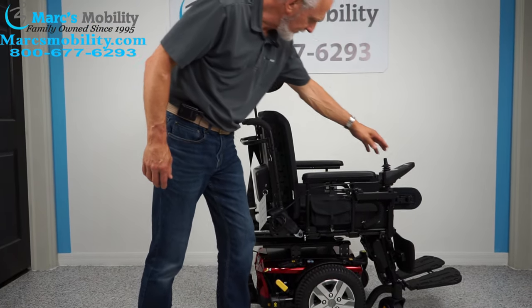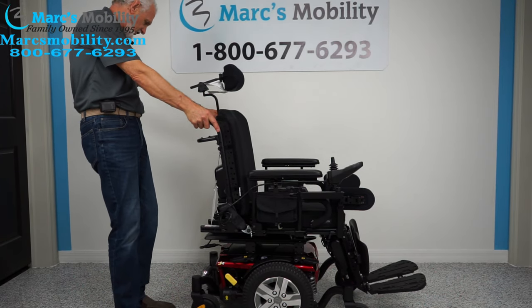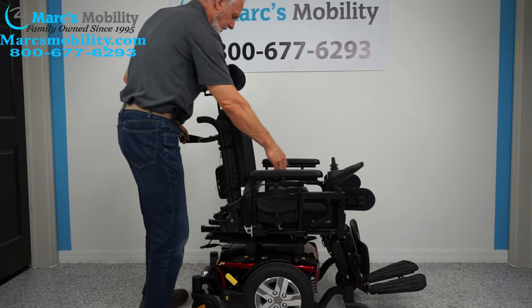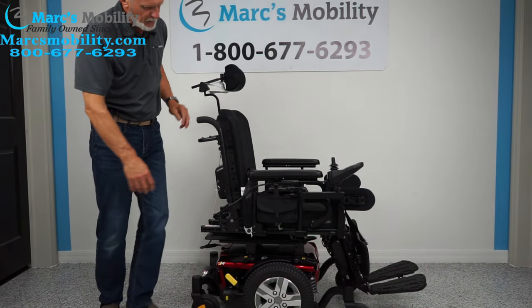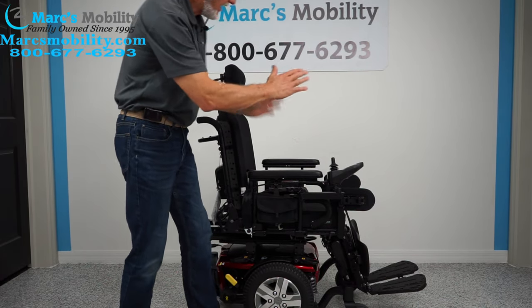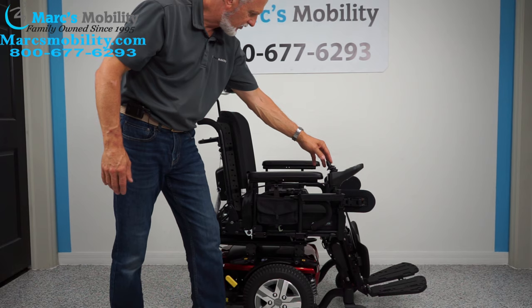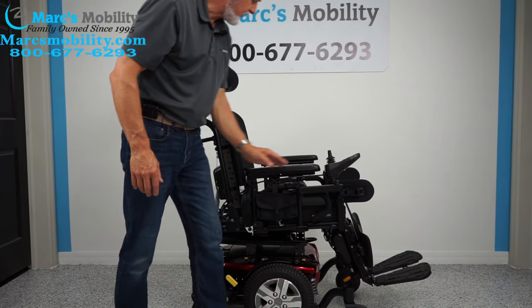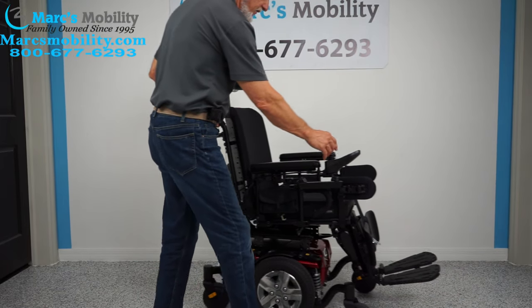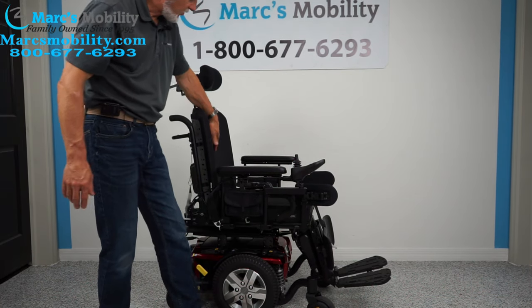The back is pretty straight right now. If you want the seat flat, the back is manual — you have to physically adjust it right here. There are three holes for adjustment. If you want the back more forward or more reclined, you can also use the electric tilt and drive the chair that way. For example, you could tilt back and put the chair in drive — now your back is tilted back more. But if you want the seat all the way down with the back tilted back, you'll have to do it manually.